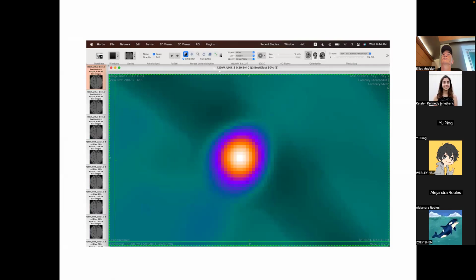So, yep. This point spread function, probably it will be dependent upon the intensity of the photons that you would be using to get the response for this dot, right? That's a great question. So the question is, does the point spread function depend on the energy of the photon that you make the picture with? The quick answer to that is no, it does not.